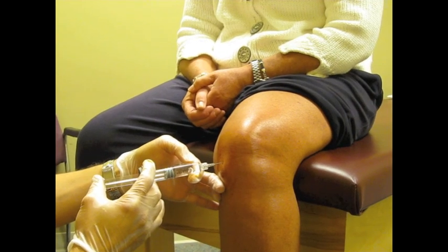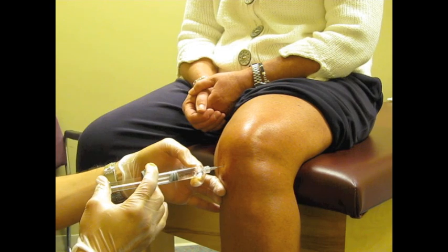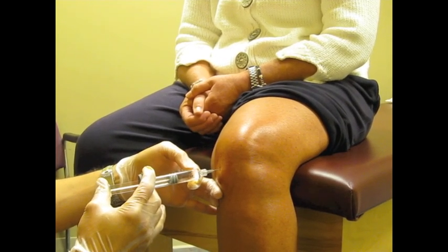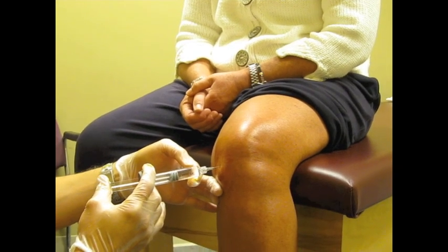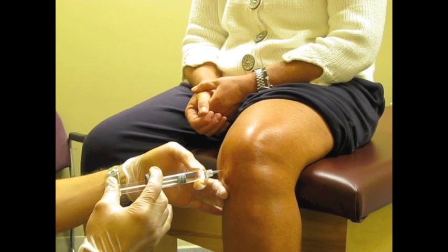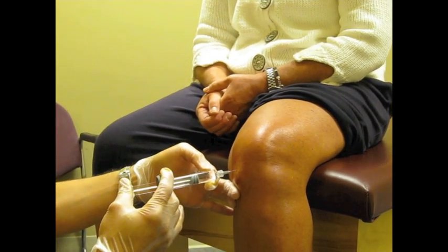The arthrocentesis is used mostly to clarify the etiology of undiagnosed joint effusions and to relieve pain in large effusions or hemarthrosis. Knee injections are used for viscosupplementation or corticosteroid treatment. This video will focus only on techniques for knee injections.